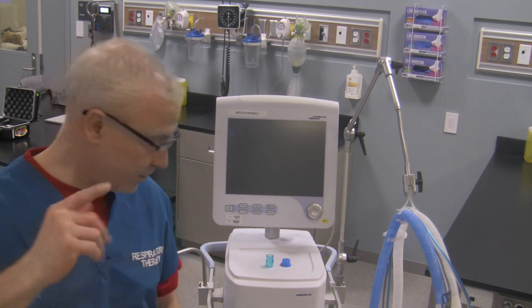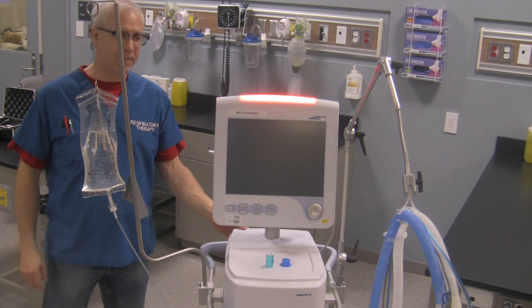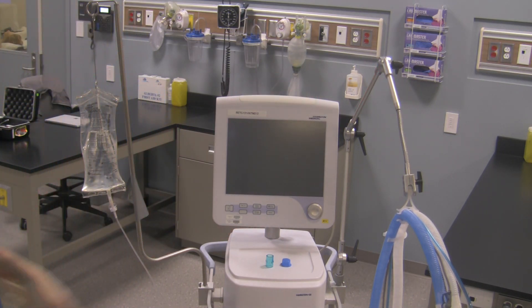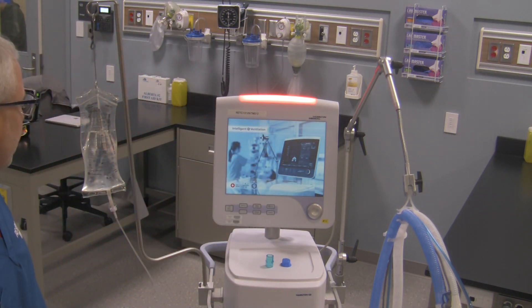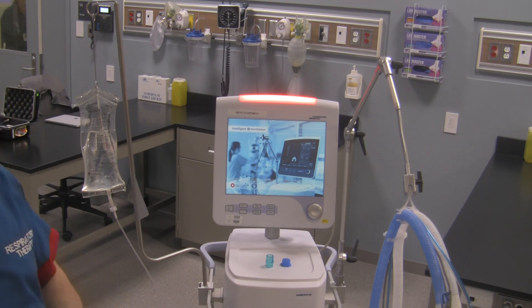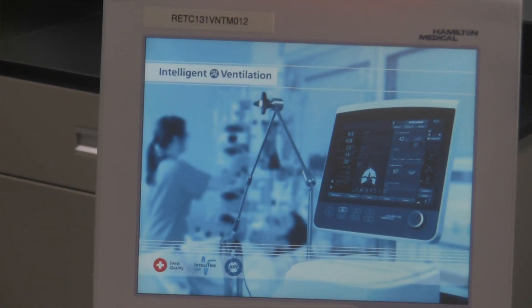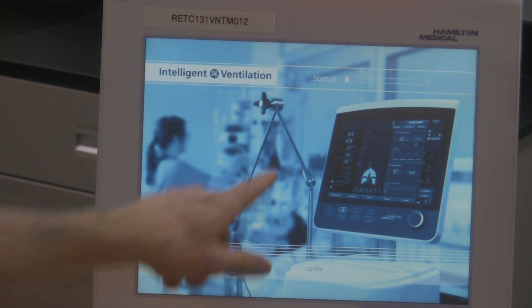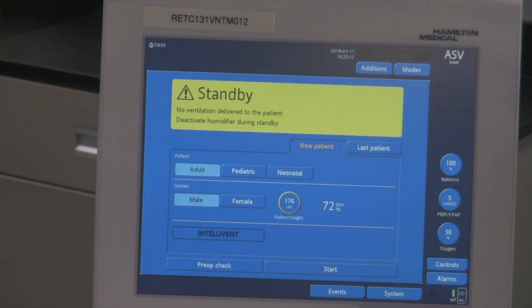Now, in order to access the test, the first thing we need to do is turn the ventilator on. We'll see it has that light at the top that goes on and brings up this screen. It's going to do its own little power check right over here. It's got the startup screen here now and it shows you how it's starting itself up, getting ready. Once it does that, it goes into this screen right over here.